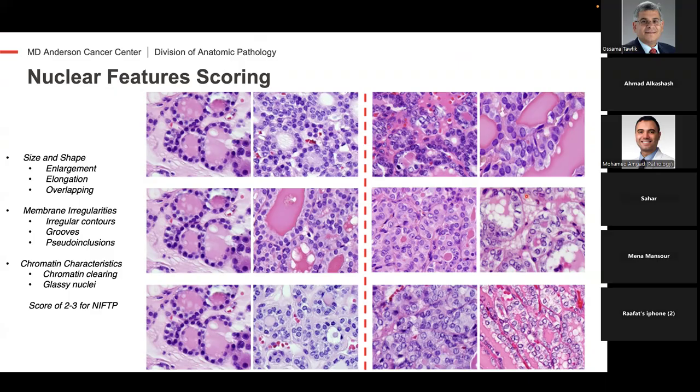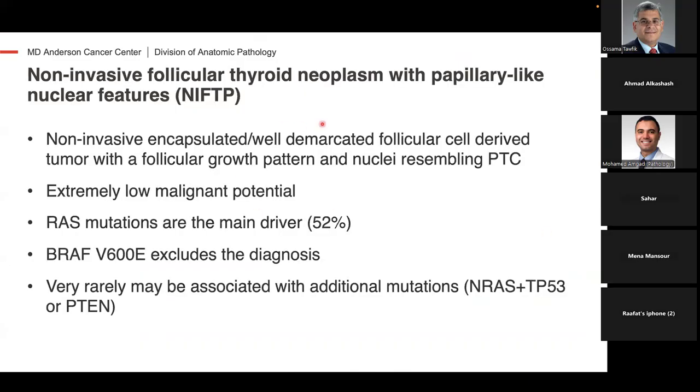Here we go. So NIFTP, once we decide that this is an encapsulated lesion with PTC nuclear features, we can call it a NIFTP.